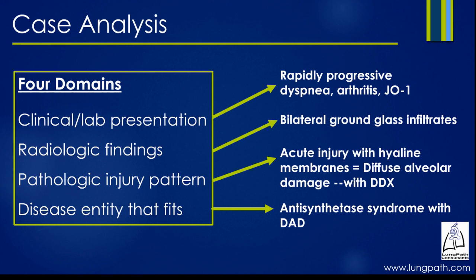And you might think this is more complex than your typical pathology case, which is why a lot of people feel that the interstitial lung diseases are really too challenging to take on as a pathologist. What we're going to show you in these presentations over 5 separate lectures is that you can manage these if you have some tools and you have some basic knowledge about diseases that affect the lung diffusely.